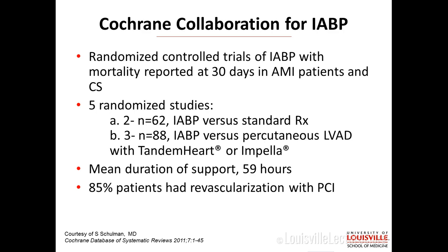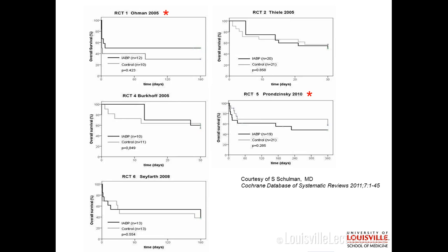That was the attempt of these makers to get those devices approved. The mean duration of support was 60 hours, so that's interesting to see how long these people needed it. And in this database of randomized controlled trials, 85% of them had revascularization. That's not modern. In the modern era, this number should be 100%. So if you look at these trials, they're all over the place.